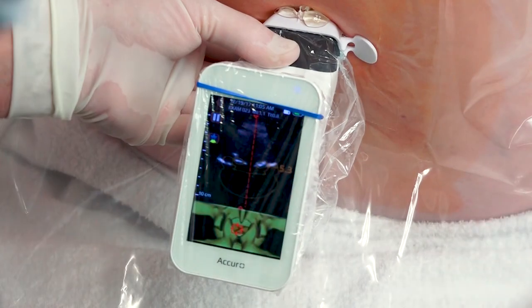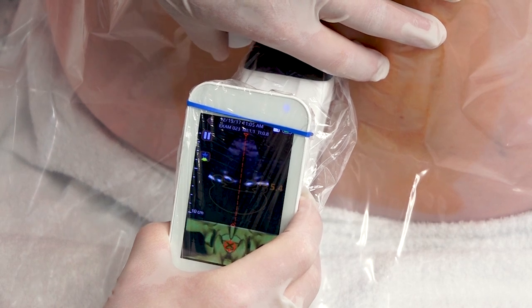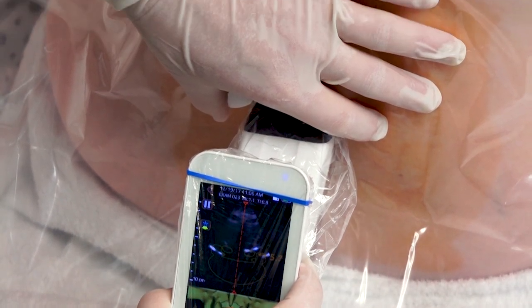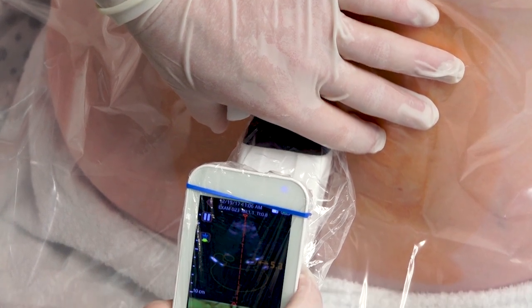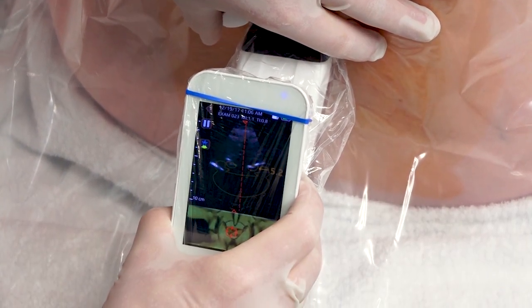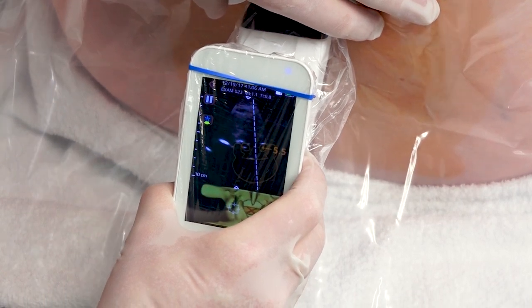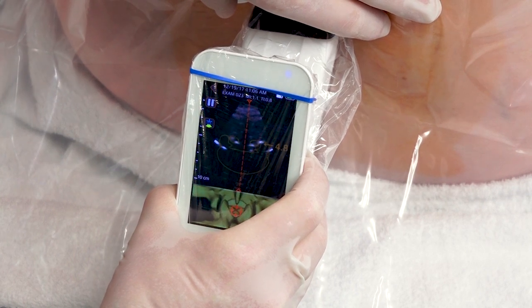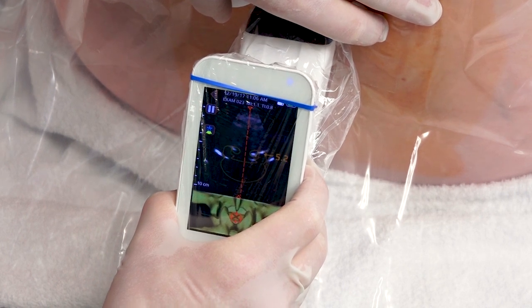Once you locate the interspace, make sure that you are not pressing on the skin, as that could affect the accuracy of the reading. You can see how now we are reading closer to 6, but when we press we are reading closer to 5. So it's very important to not press on the skin and to remember the trajectory of the ultrasound beam.